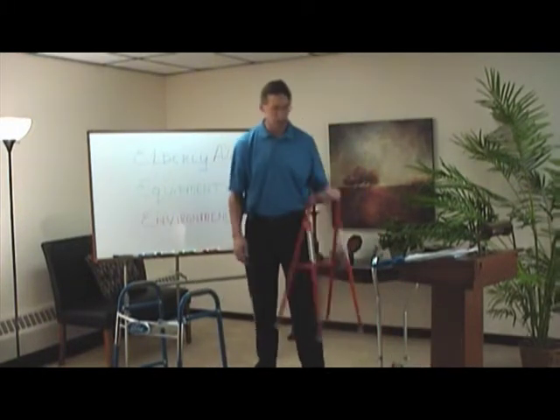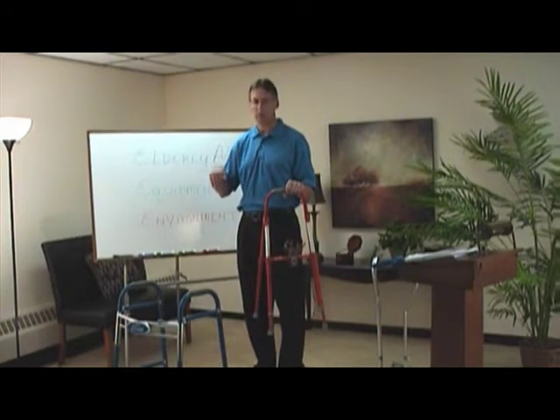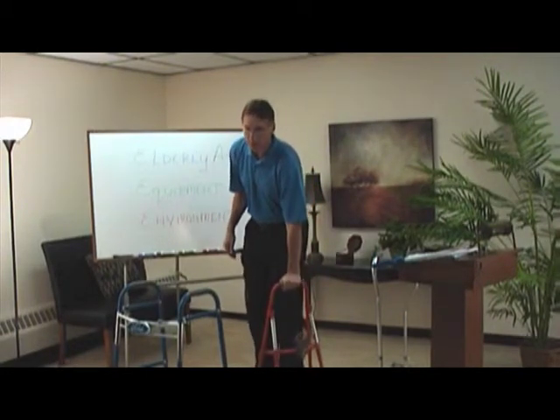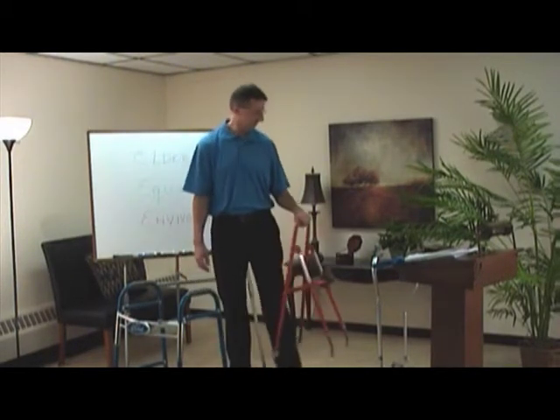Again, this hemi walker is very good for people who only have one arm to lean on for whatever reason, if you have a stroke or amputation or arthritis, and they can only lean on one side. These are very stable and can move along nicely, so it's a nice option.